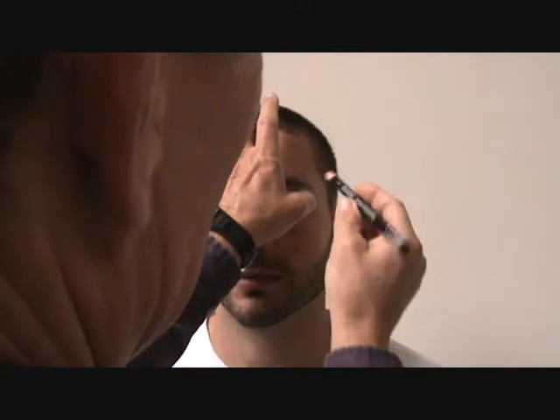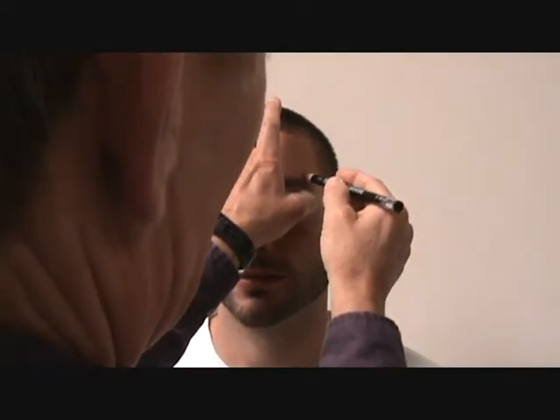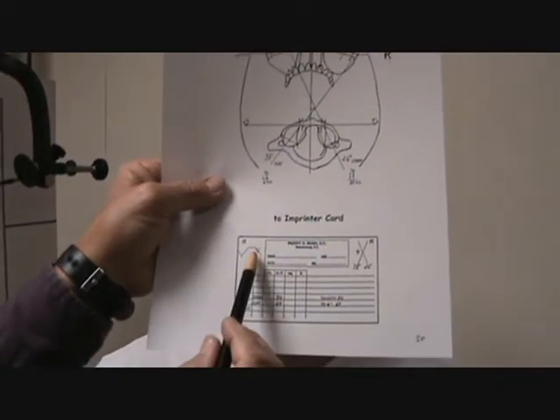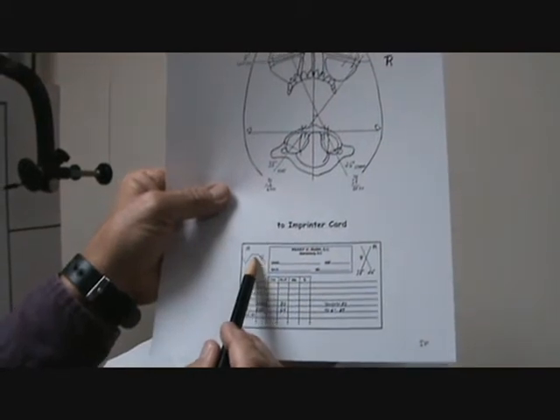Let's mark the other orbit. There's the lateral aspect coming up, there's the medial aspect coming up, there's the center. As I transfer this dot, there's the midline, there's the quarter section — I'll come between the midline and the quarter section — and that's where my vertical collimator crosshair will have to pass when I'm shooting through this maxillary sinus.